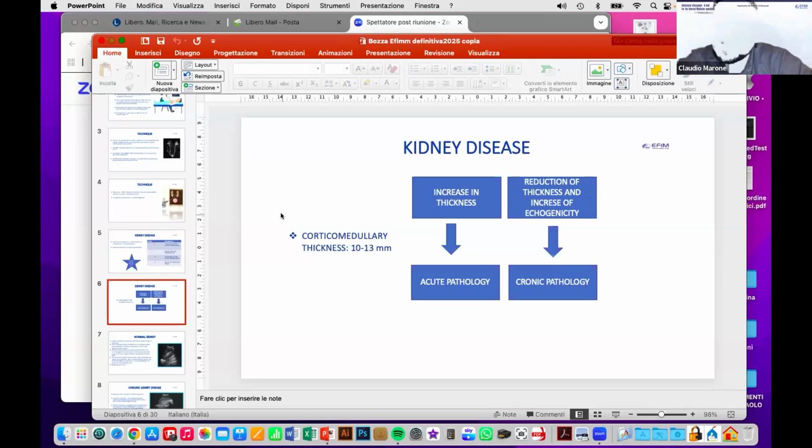Okay. And then we have a third question for you. Can the ultrasound help in the diagnosis of pyelonephritis? What do you think, Marone? Pyelonephritis. Yes, yes, they can help us. I told you during the presentation.